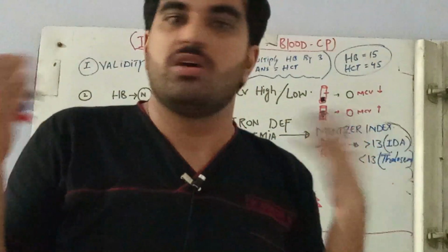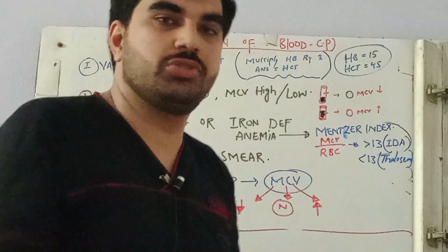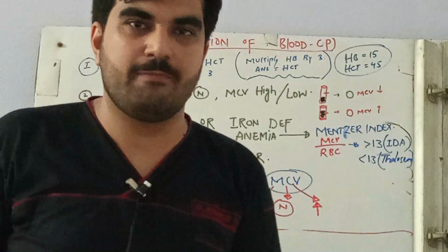Today I'm going to talk about a very important topic, that is the interpretation of blood CP. You can diagnose a variety of diseases, and you can say what is going on with this patient, what is wrong with this patient by looking just at the blood CP.